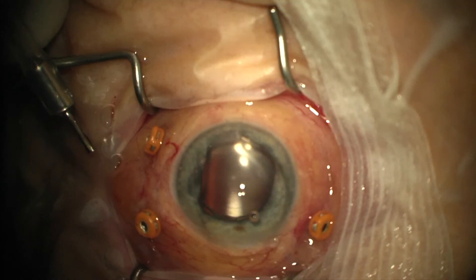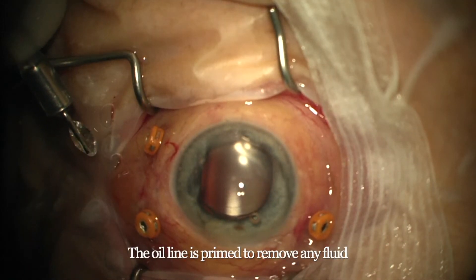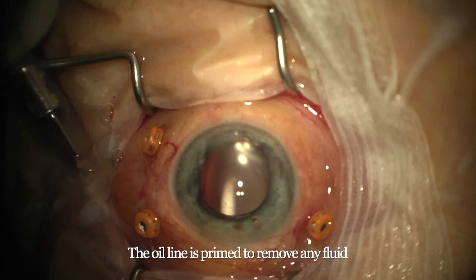This is a 23 gauge vitrectomy setup. The initial step is to take the infusion cannula out, prime it with oil, and put it back.